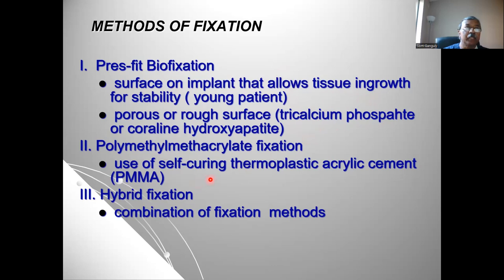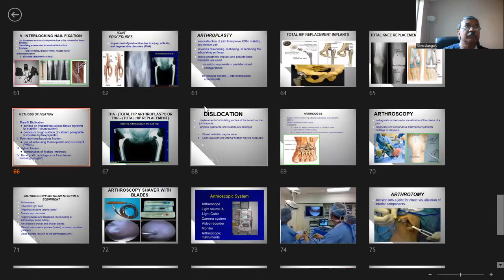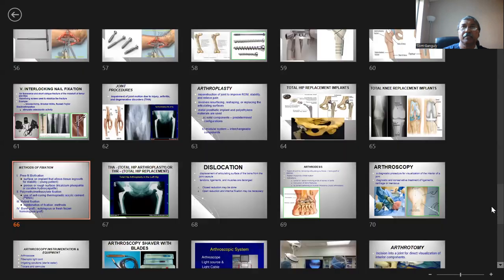The other category that we have is simply the cemented hip, where polymethyl methacrylate fixation is used. This PMMA, or polymethyl methacrylate, is first mixed in a system on our back table. Then it is transferred into these type of, let me show you the cement gun.